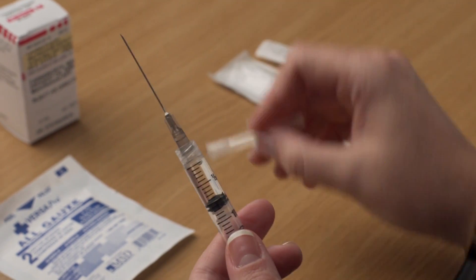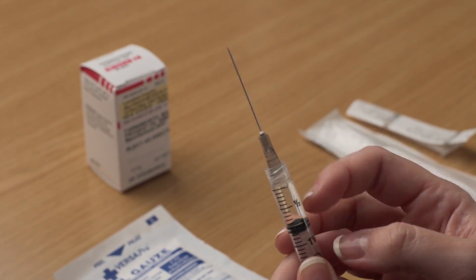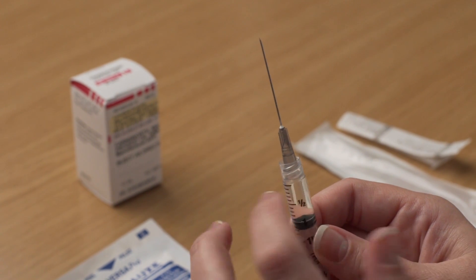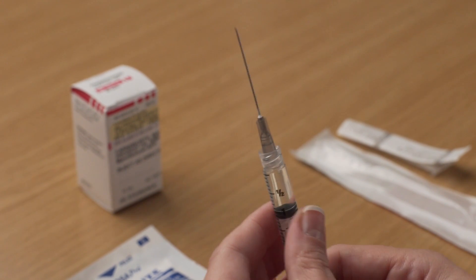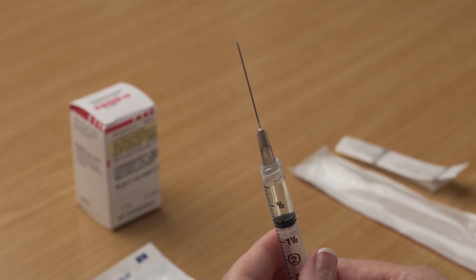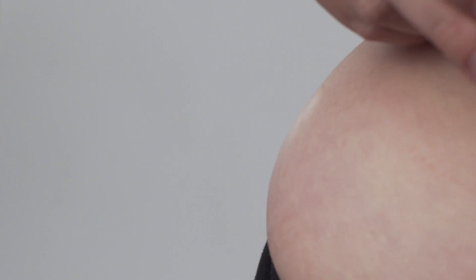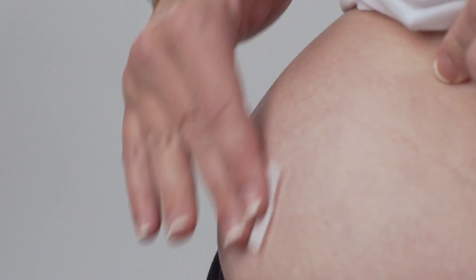Carefully pull or twist off the protective needle cap. To remove any air bubbles in the syringe, point the needle upward and gently tap on the syringe. When all bubbles have risen to the top, slightly press the plunger until a small drop of solution appears at the top of the needle. Choose an injection site as directed by your healthcare provider. Common sites for intramuscular injections include the hip, upper outer quadrant of the buttocks, and outer area of the mid-thigh. Clean the injection site with an alcohol swab and allow to air dry.